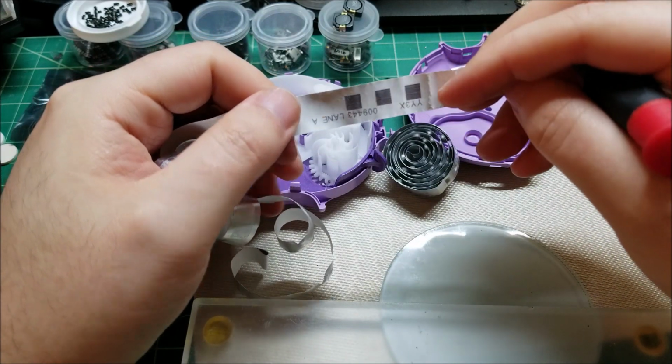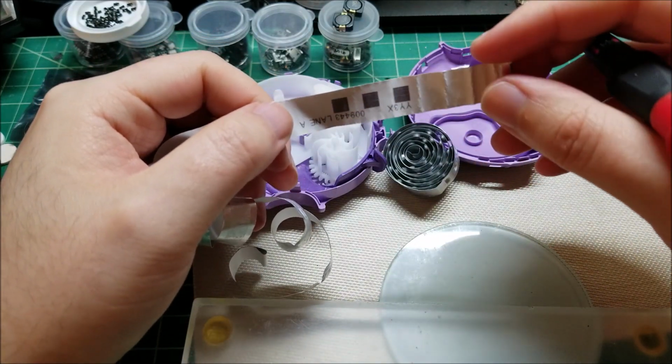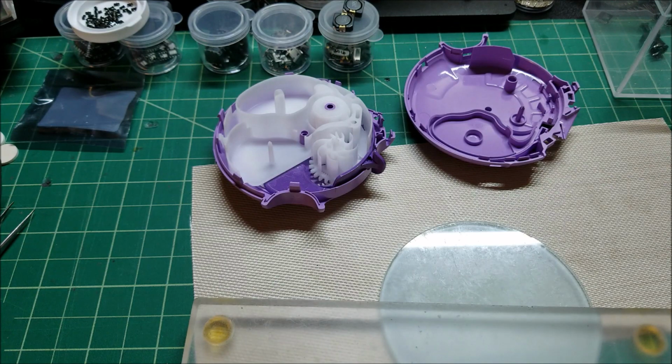And on here is some information that's printed at the factory, I guess, during the manufacturing process. But yeah, those are the two parts there.